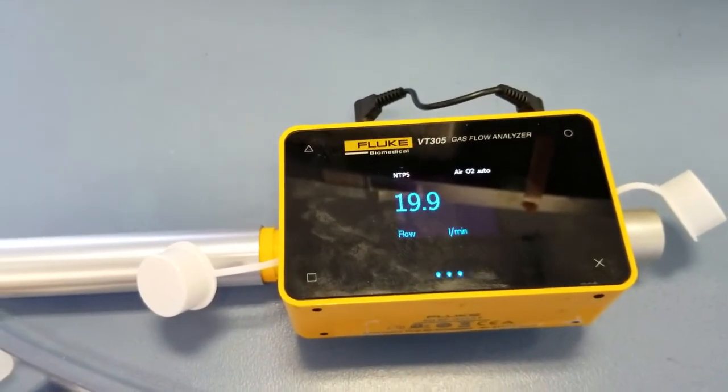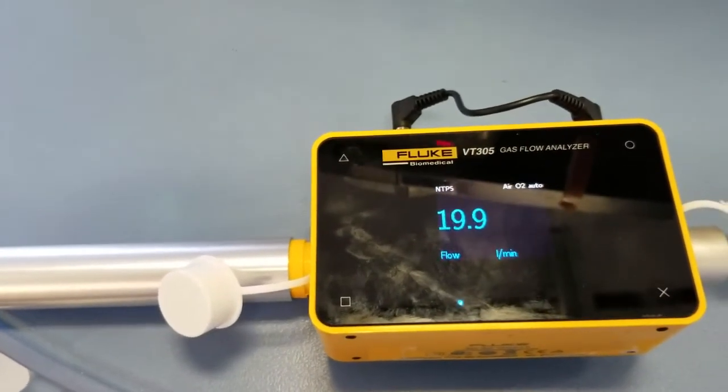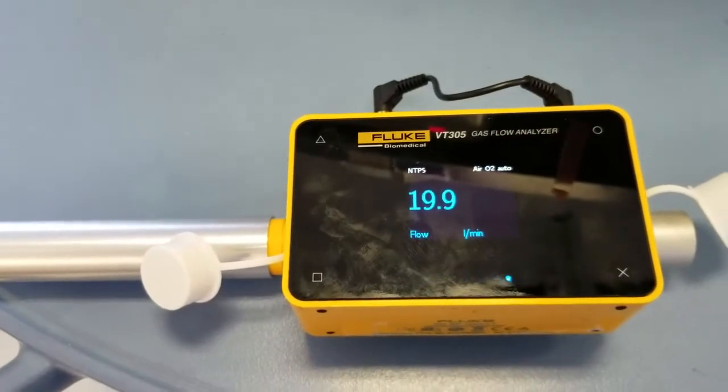If you just want to do oxygen, change your settings to oxygen only. If you want to do air only, change your settings to air only. That's how simple it is to do a flow test.